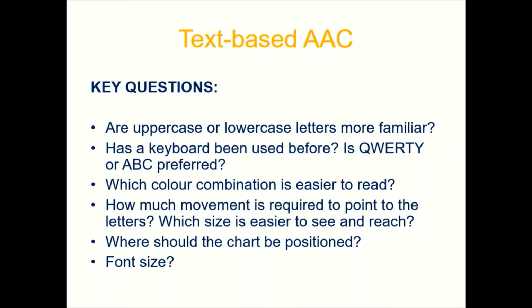How much movement is required across the chart for them to point to each letter? Where should this chart be positioned? Should it be held right up in their eye line? Does it need to be lowered down? Are they going to have it on their lap? Are they going to have it stuck up somewhere? And what font size are you going to need? What font style are you going to need? Again, you can ascertain all this through trial and error. Just try it, see how it goes, and tweak as you go.